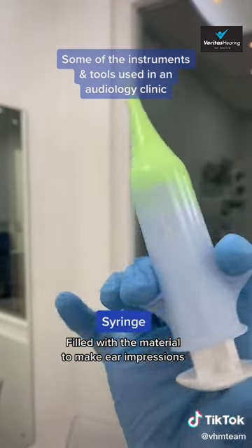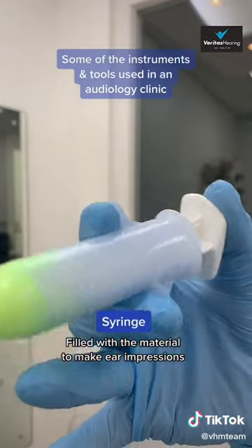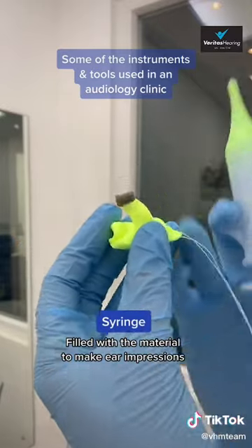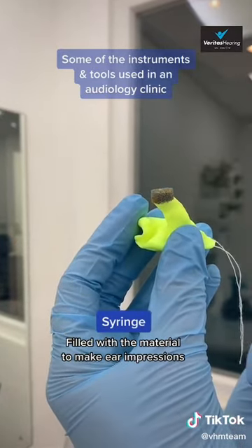This is a syringe that is filled with the material used to make ear impressions like this one, and on top you can see the foam that protects your eardrum from the material.